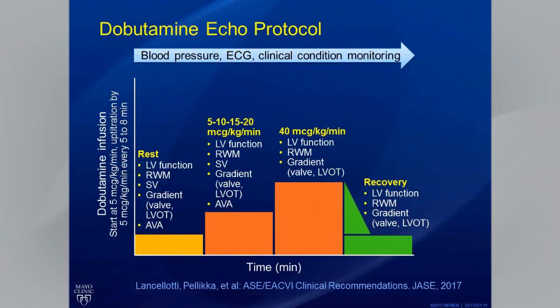This shows our dobutamine echo protocol. And so when we do dobutamine testing for patients with a non-ischemic protocol, or where we're looking at an inotropic response in a heart failure patient or need to measure multiple valve parameters, we usually use 5-minute stages to give us a little more time to get these parameters as the heart rate gradually increases. It may take a little bit more time to get the full contractile reserve response to dobutamine.